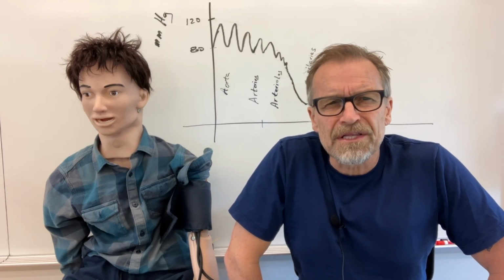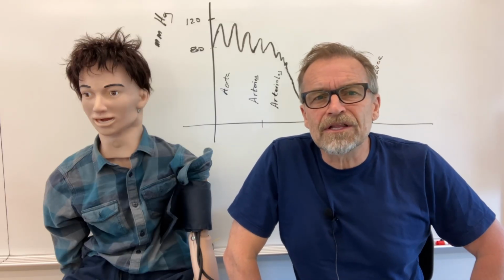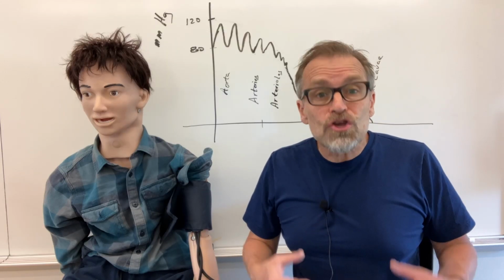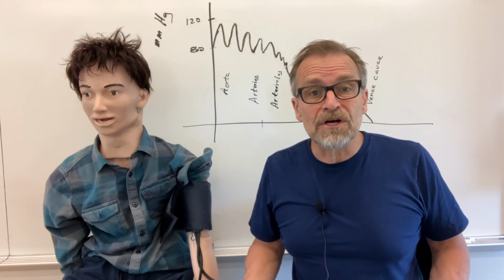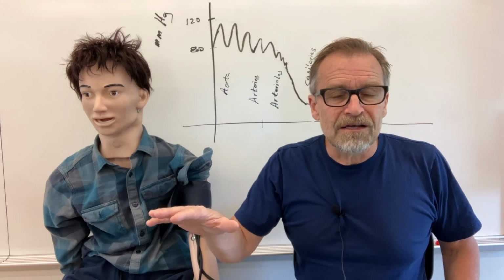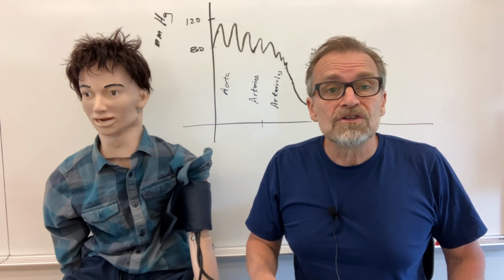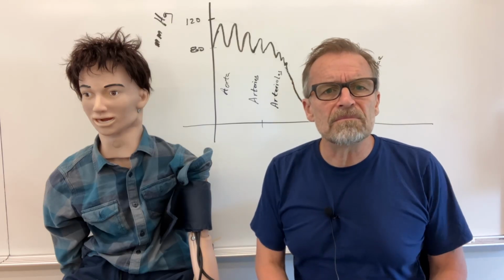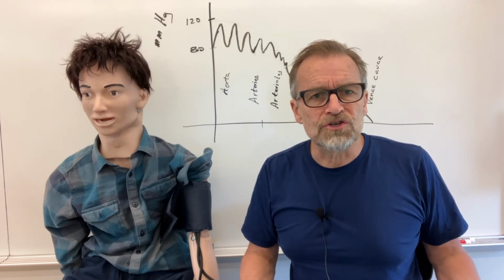It's a little bit of a trick to these, by the way, because they're just measuring saturation, not necessarily O2 saturation. So for example, if you were exposed to carbon monoxide, your hemoglobin would be saturated with carbon monoxide. This thing would tell you you've got 98% saturation. You're good to go. No, you're not, because carbon monoxide is not something your organs need. So it's not perfect, but in a hospital setting or a clinical setting, it's a good way to measure how much oxygen is being delivered to your tissue.